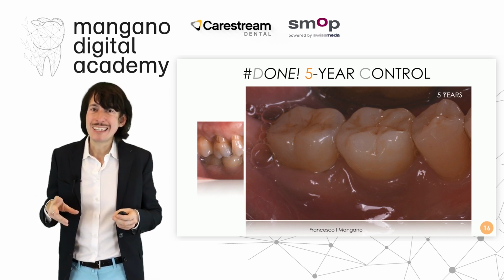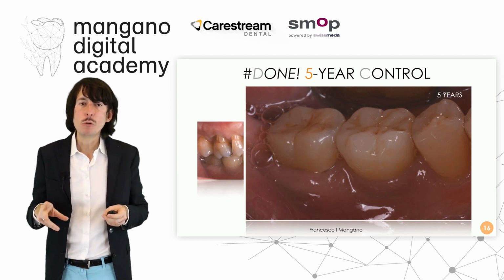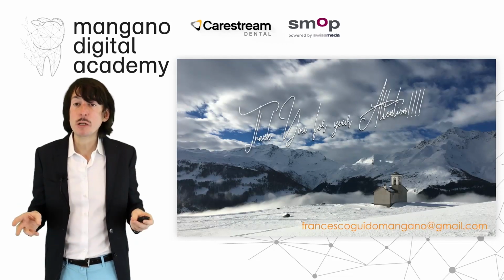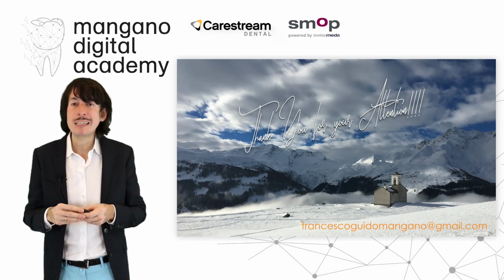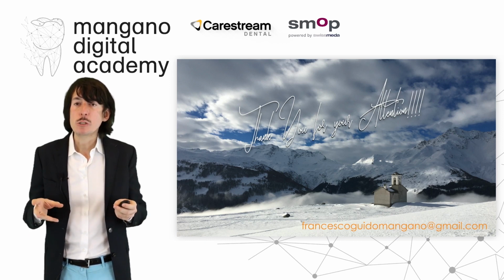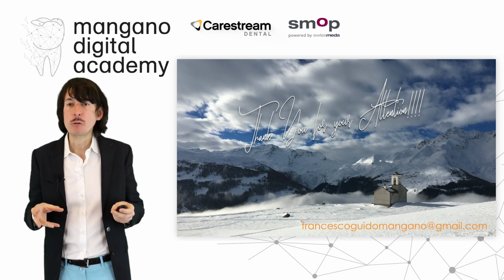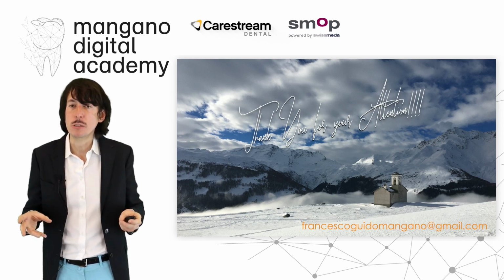So what we are doing here is absolutely very satisfactory from the aesthetic, from the functional point of view, and from the perspective of the biology, because zirconia is an incredible material, also in biological terms. So thank you very much for your kind attention, and consider also in your practice the possibility to use individual hybrid abutment instead of screw-head superstructure, because the quality of this workflow, in my opinion, is really high and needs to be considered not only for the aesthetic areas but also for the posterior area.